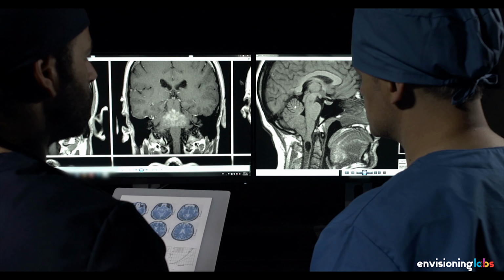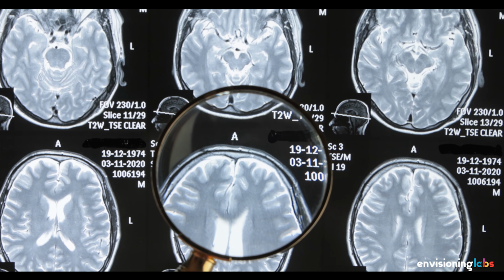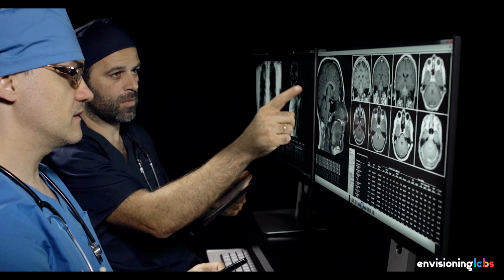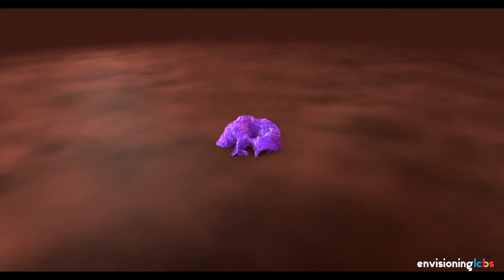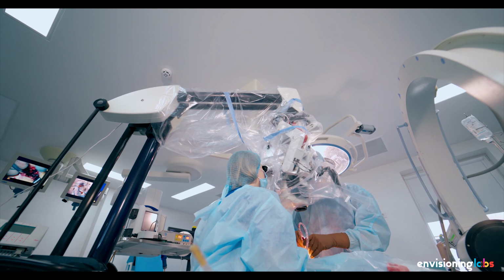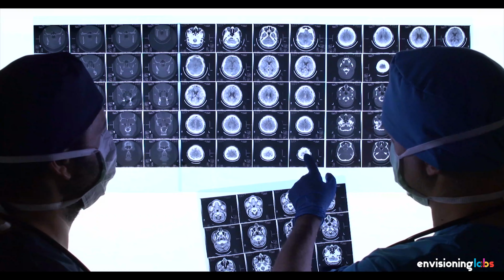When there is a tumor in the brain, it has to be removed by neurosurgeons. However, some low-grade tumors are hard to see because they look similar to the regular brain tissue. It is important to remove the tumor fully to ensure that the tumor doesn't grow back. It is also important to cut away only the tumor tissue because removing regular brain tissue could cause brain damage.